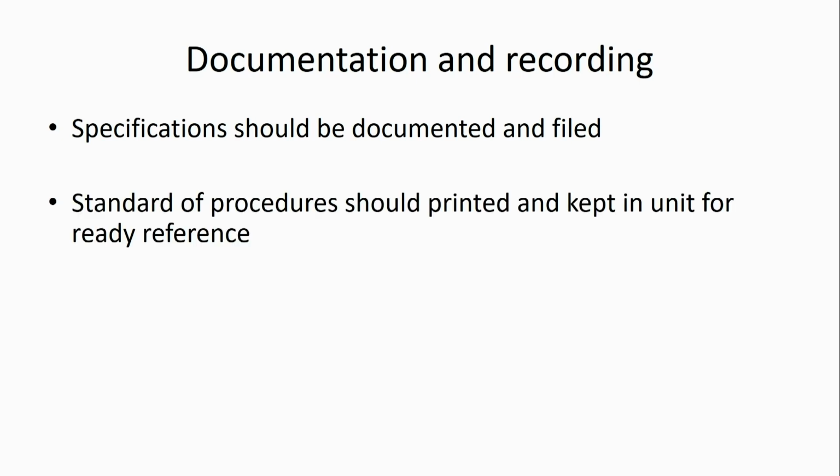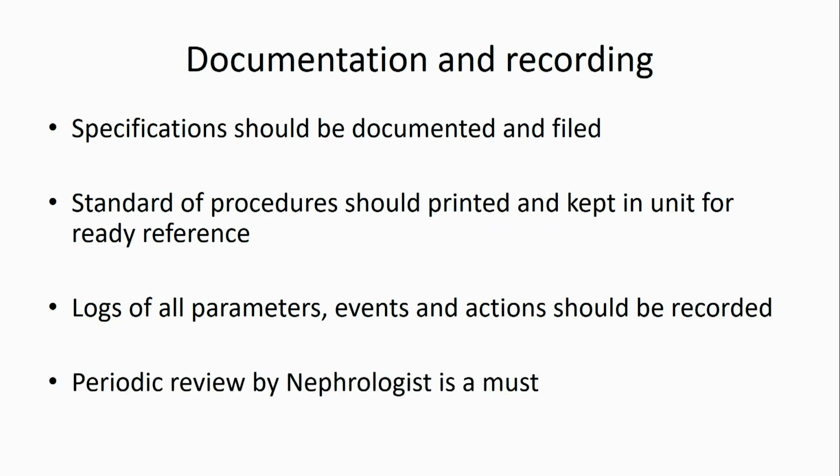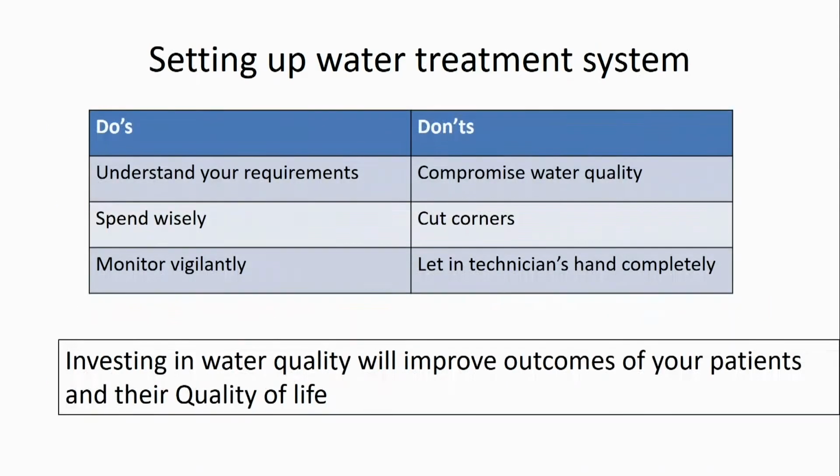The standard procedures for disinfection and maintenance of the tank should be printed and kept in the unit for ready reference of technicians or whoever is looking after the unit in your absence. The logs of all parameters, events and actions, as Sir told in his talk also, any obscure event happening in the unit should be recorded and periodically reviewed by a nephrologist.